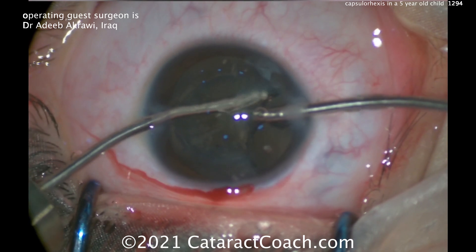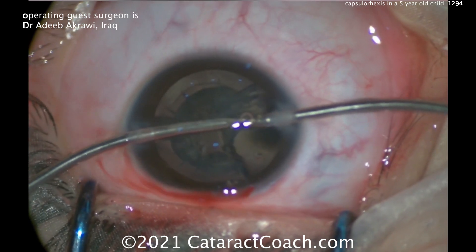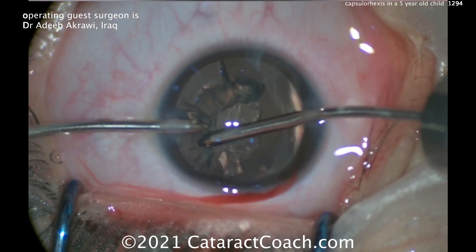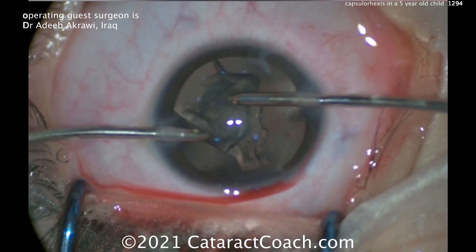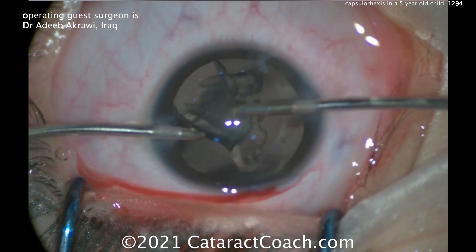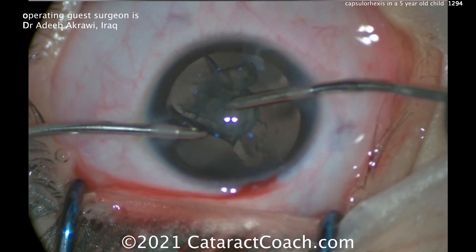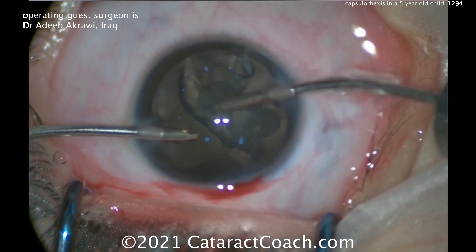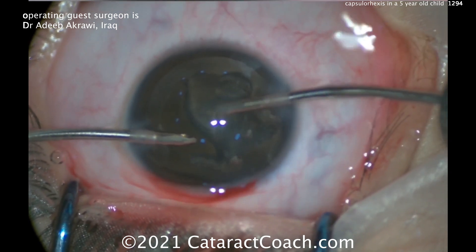Notice there's a little bit of bounce in the anterior chamber — a little bit of fluidic instability. Here's a case where I'd increase the infusion pressure or bottle height and I'd decrease the flow rate. Sometimes these 23-gauge bimanual instruments aren't getting enough flow inside the eye. You want to increase infusion and decrease outflow just to get more chamber stability.